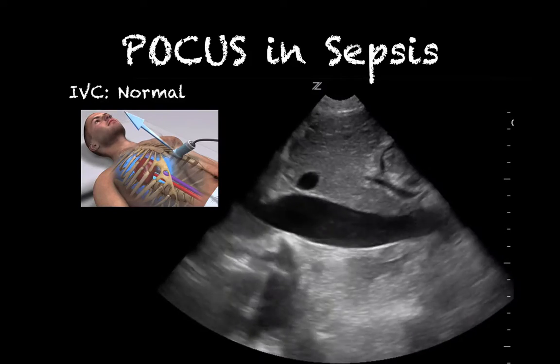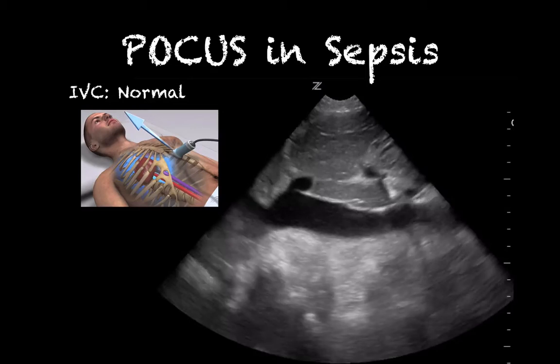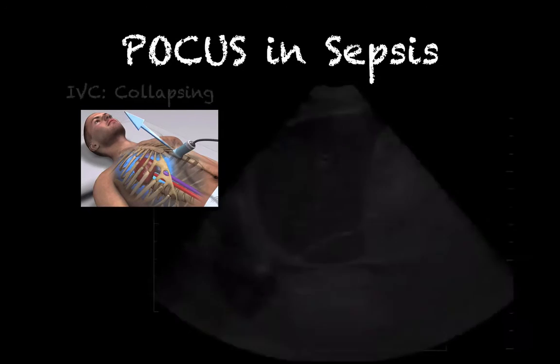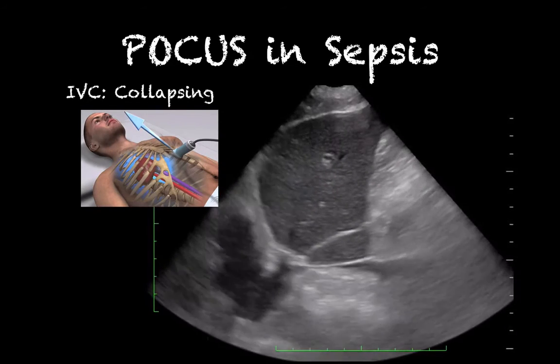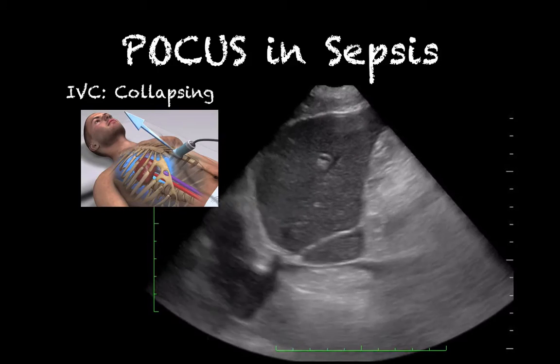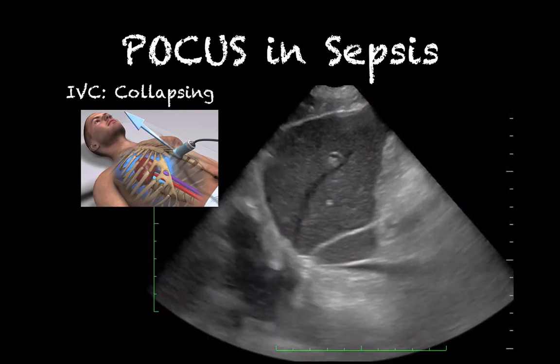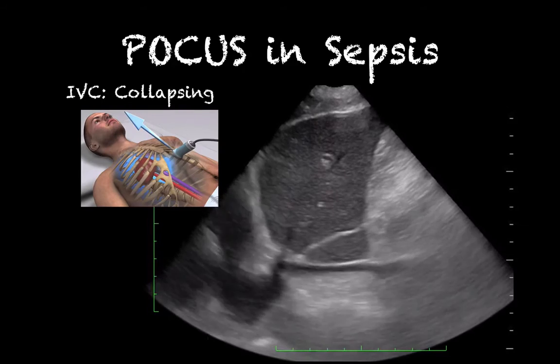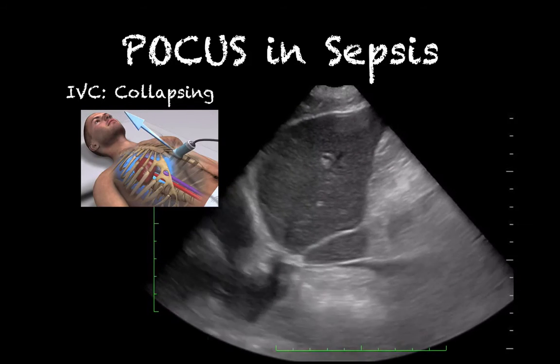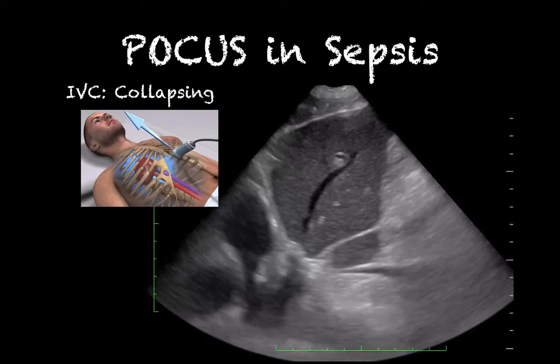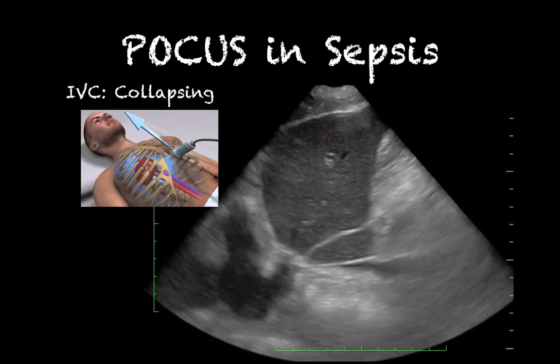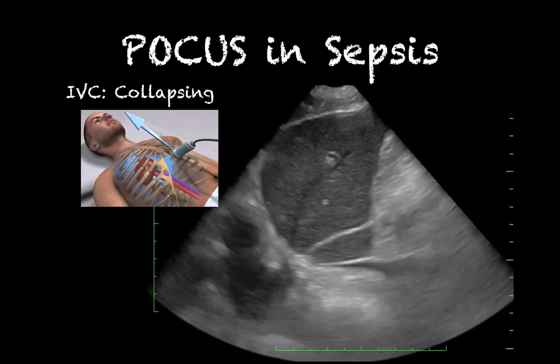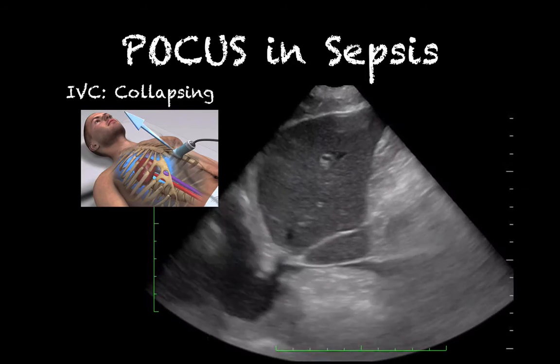In contrast, here we see a collapsing IVC. Systemic vasodilation means less blood in the IVC, so it appears flat and collapses more than 50 percent with respiration, or completely, as in this image. This is often seen in the hypotensive patient with septic shock.